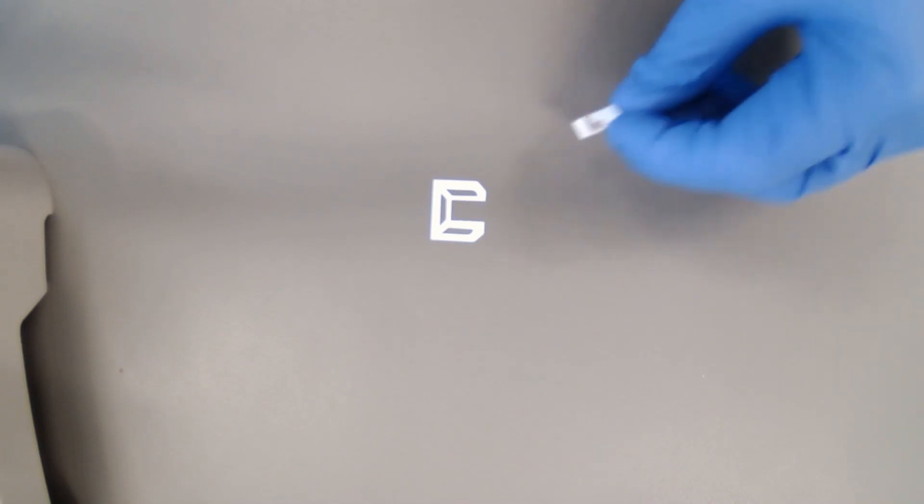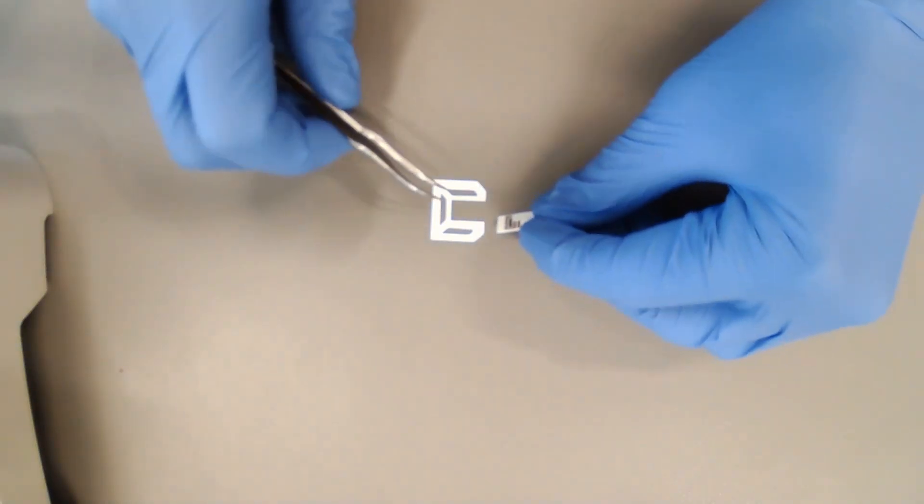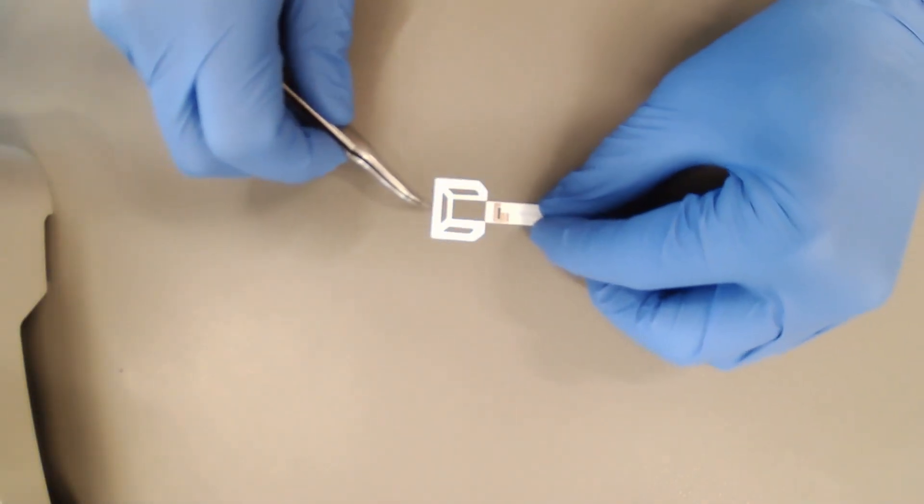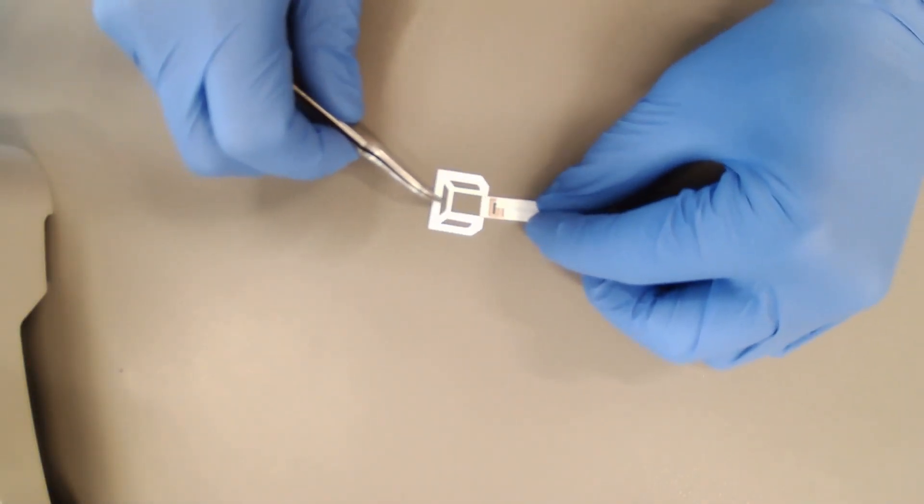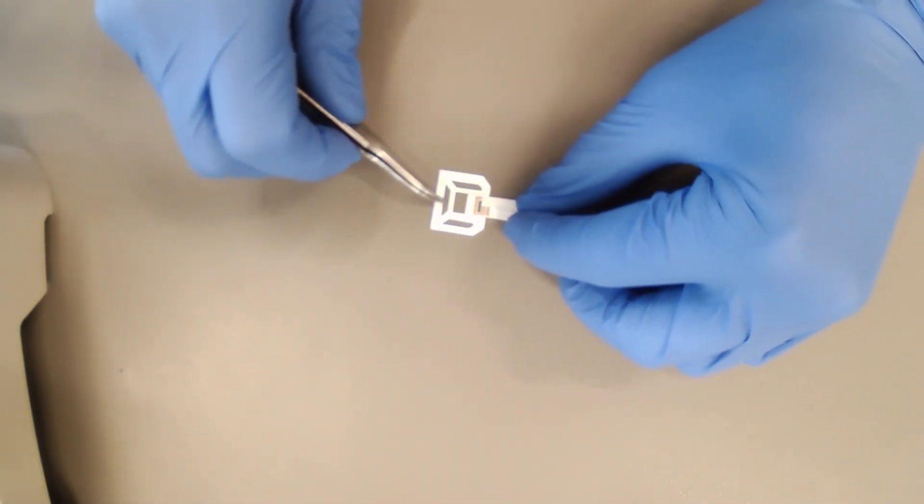The second layer attached is the microchannel. These microchannels ensure that the sweat is conducted from the collecting reservoir to the micro reservoir layer.